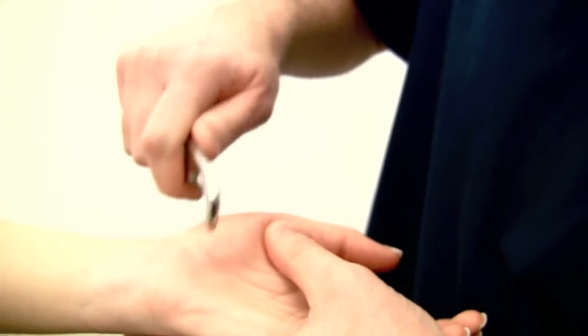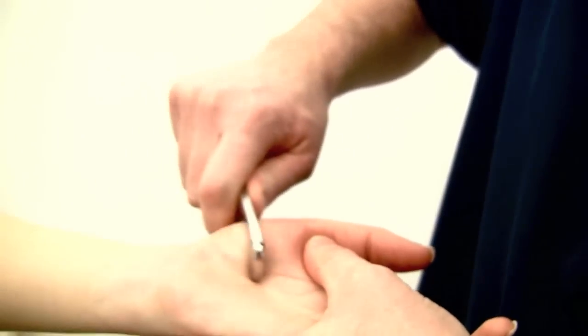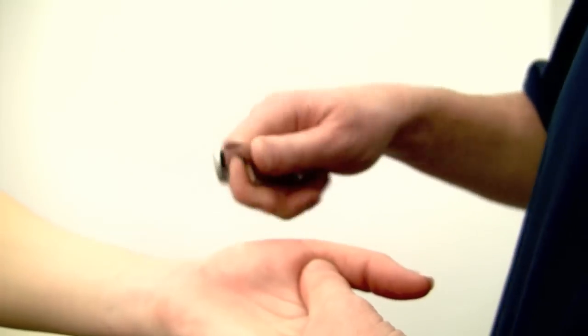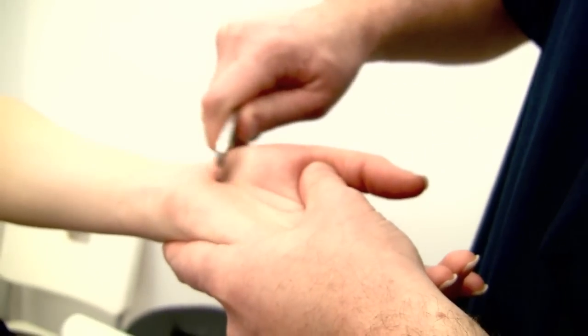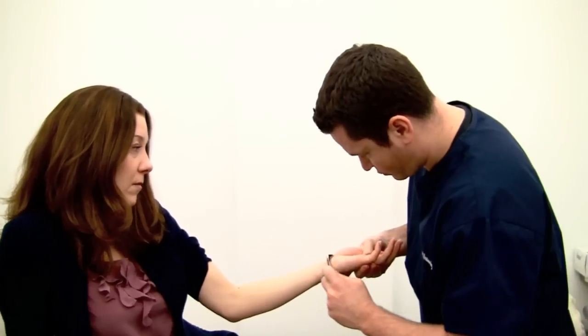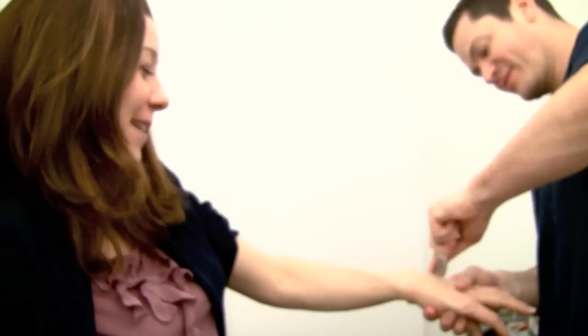As you can see, you have some inflammation building up, which is a good thing. Graston's great in the fact that it causes inflammation. In this case, inflammation is a good thing because you want to bring fresh blood and oxygen to the area to help clean out all the toxins that have built up and help heal the tissue faster. It's a good pain. It hurts a little bit, but I think it's helping, so hopefully it'll be worth it.